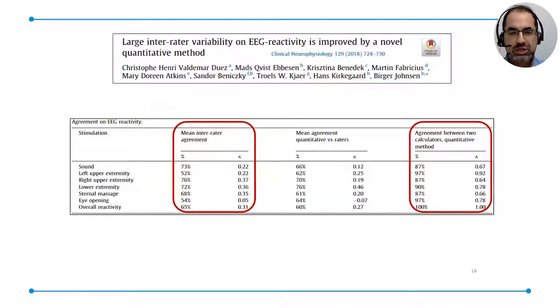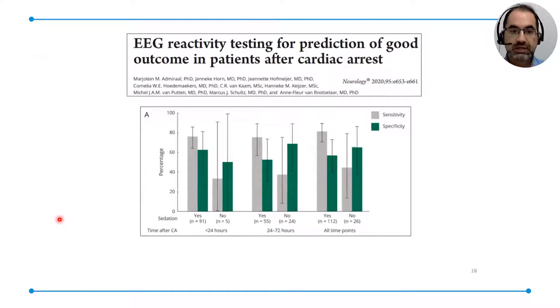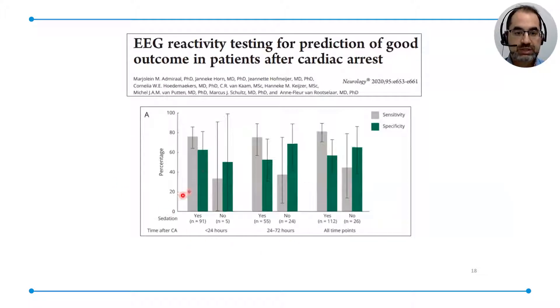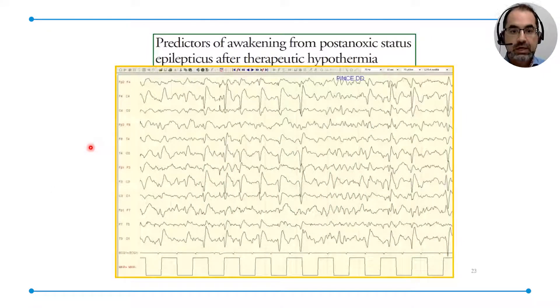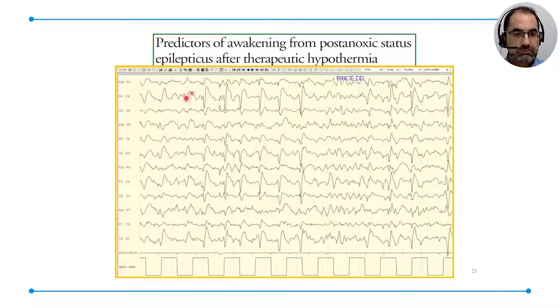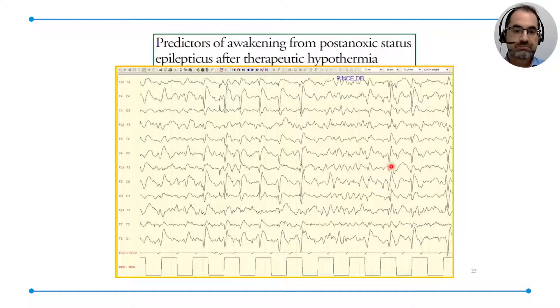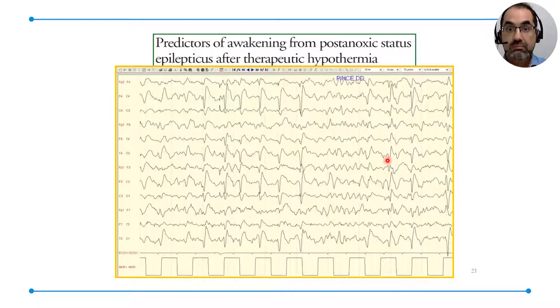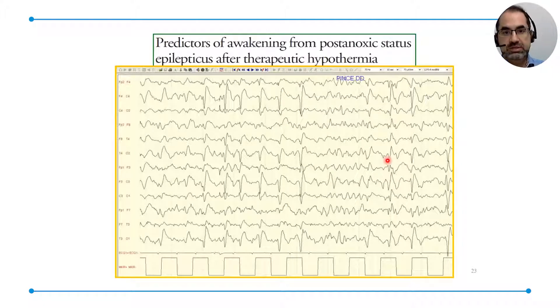Reactivity is a very challenging and debated issue. Present reactivity has been linked to anticipation of good outcome with sensitivities of about 80% across time. Look at this example: this patient had periodic discharges on a reduced montage on a theta background, and then you apply a painful stimulus and the background changes — that's good. If you see that, please try to treat the patient, especially if brainstem reflexes are present and if SSEP cortical responses are there.